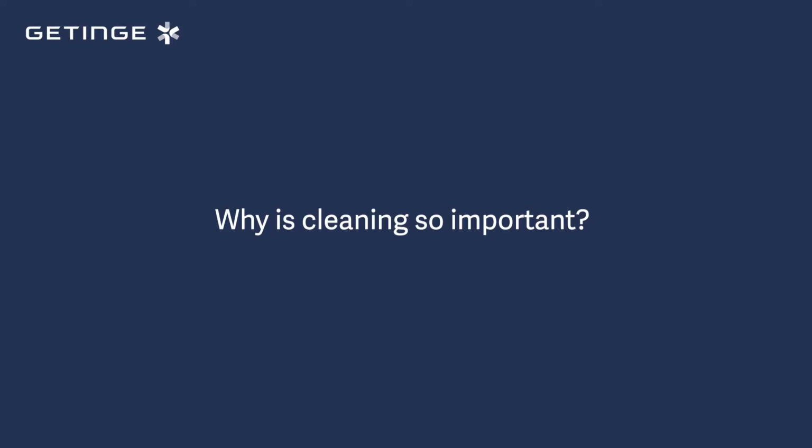Why is cleaning so important? Mainly because if cleaning is not completed, effective sterilization cannot be done properly. The main purpose of cleaning is to remove the gross debris and the biological matter.